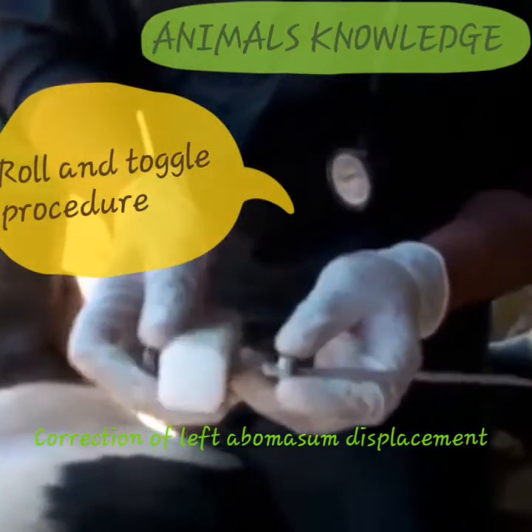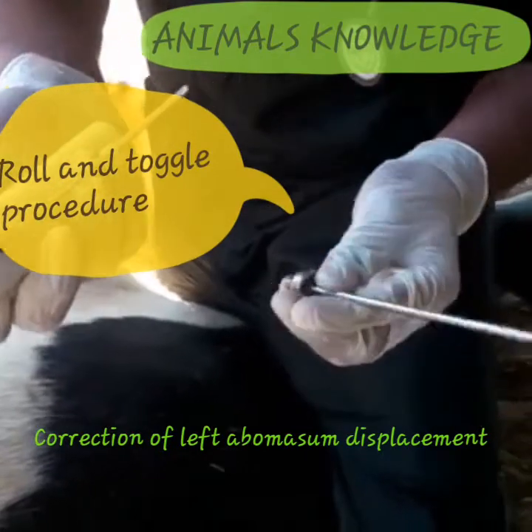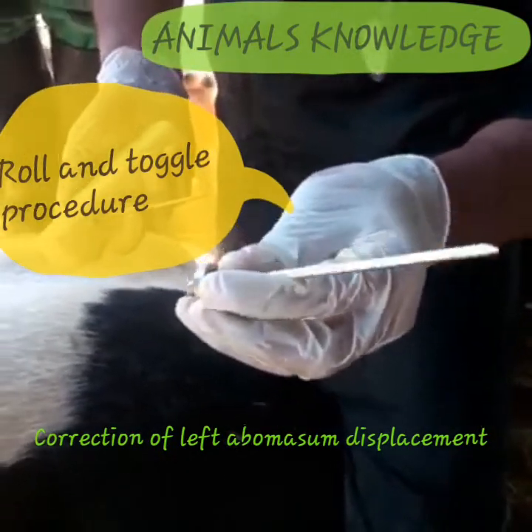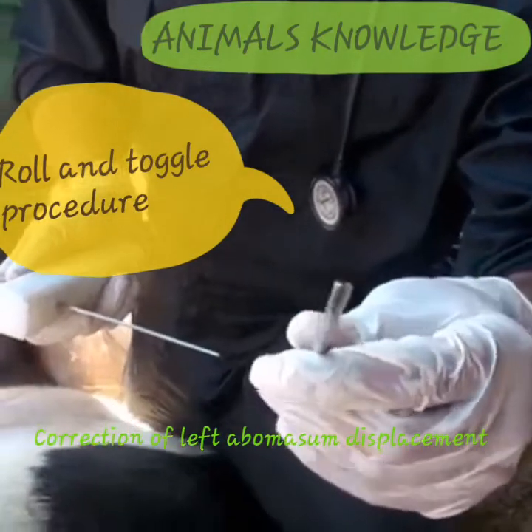The toggle set has three parts: one handle, a solid stick, and a trocar that is hollow from inside and sharp from the other end.